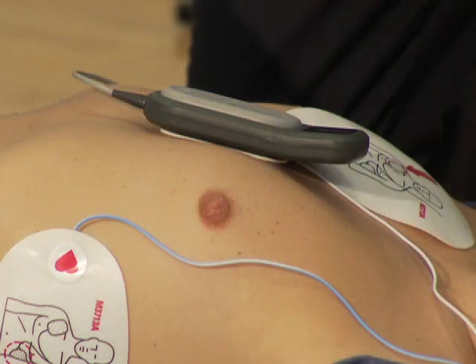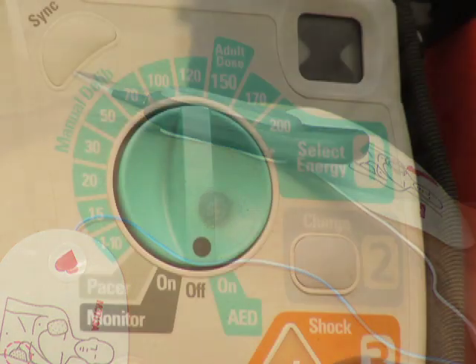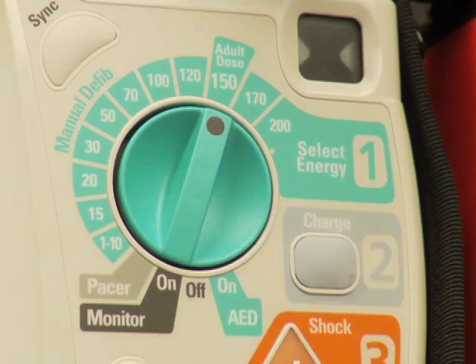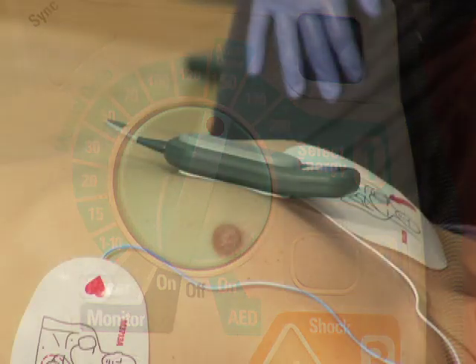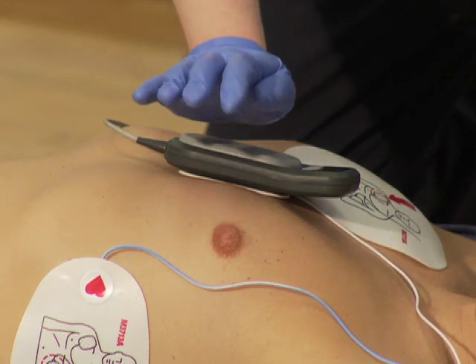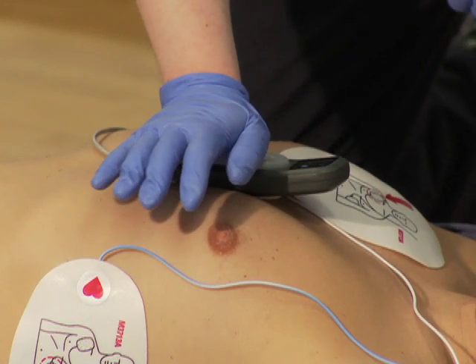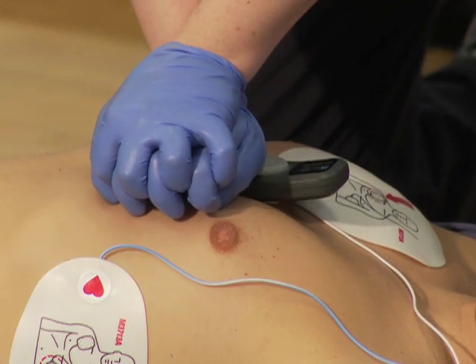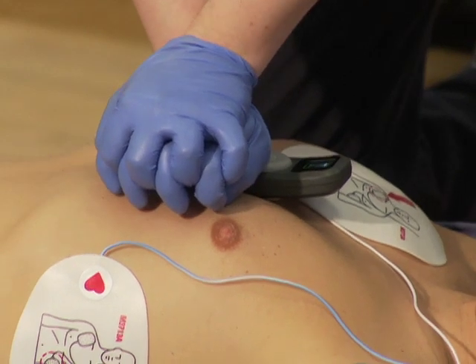It is acceptable if the CPR meter overlaps a defibrillator pad. Set the HeartStart MRX to manual defibrillation mode and start CPR compressions. Using standard CPR technique, place the heel of one hand directly on the compression area of the CPR meter and place your other hand on top of the first. Be sure to position your hands so you can see the display area of the CPR meter.